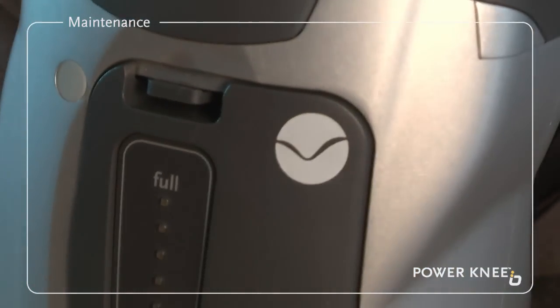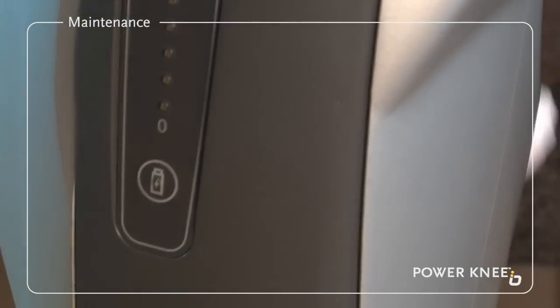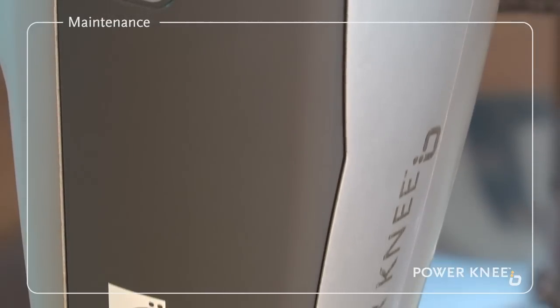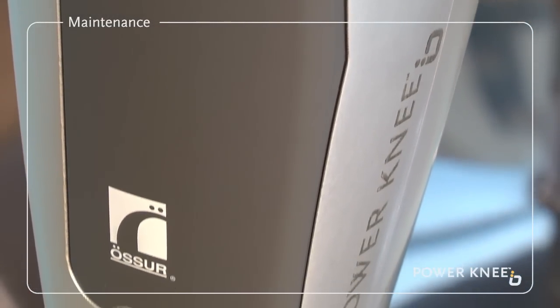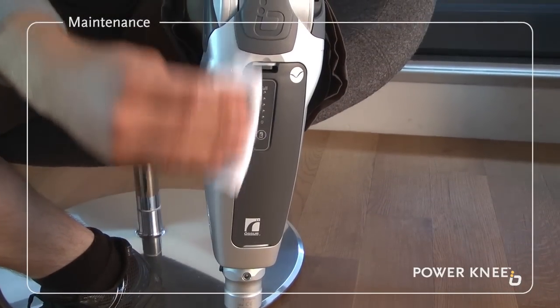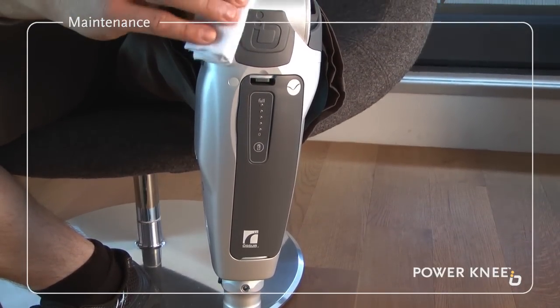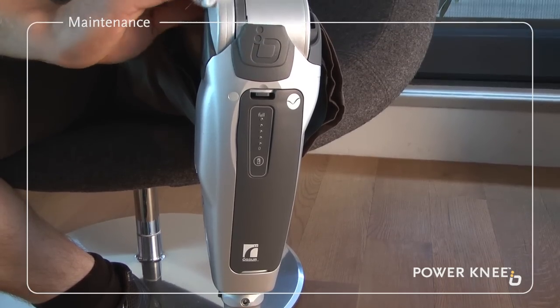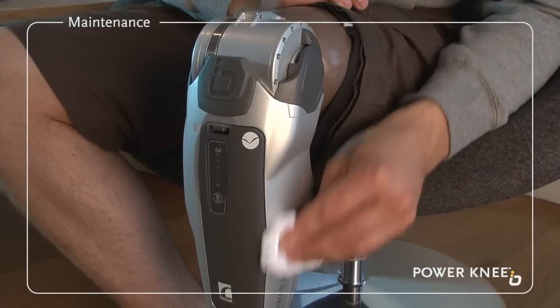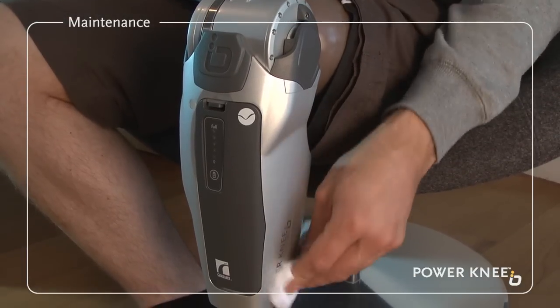Never take your Power Knee apart or attempt any form of repair. Not only will you automatically void the knee's warranty, you might unintentionally create a hazard that could cause you harm. If something seems to be wrong with your Power Knee, talk initially to your prosthetist or healthcare provider to ensure you are using the knee properly.